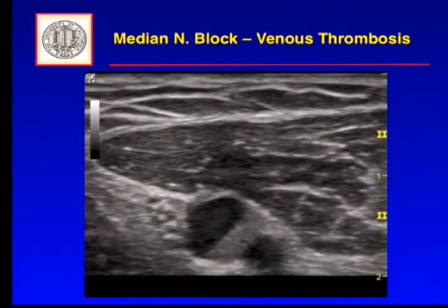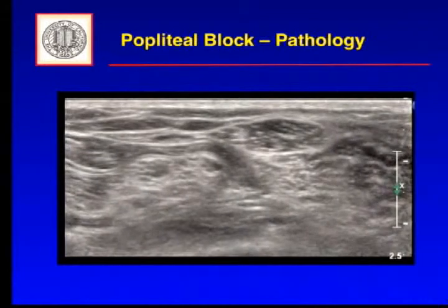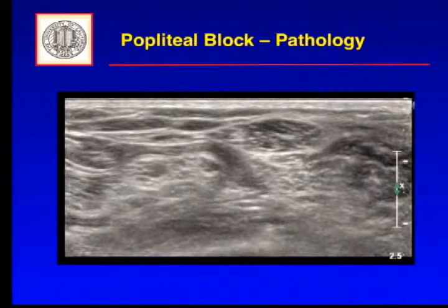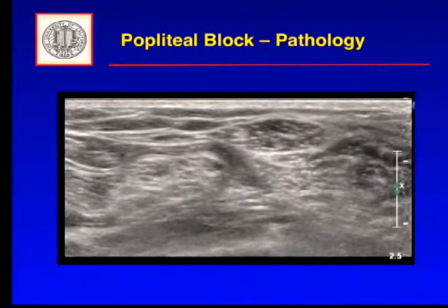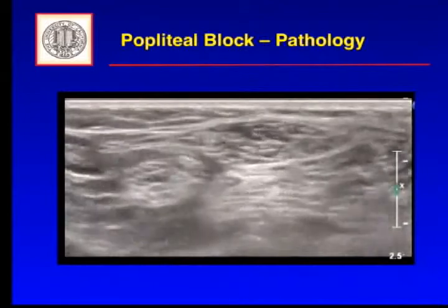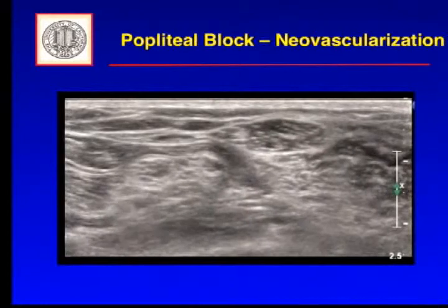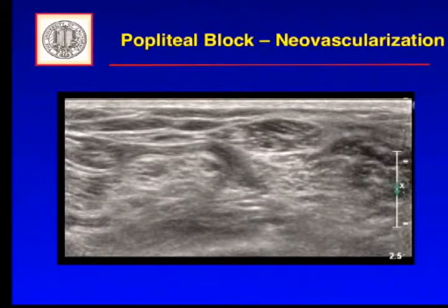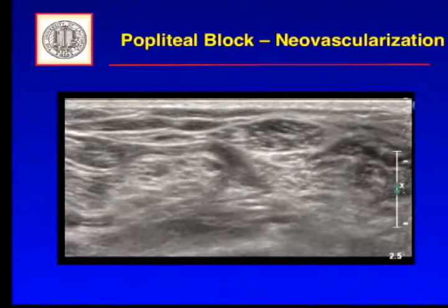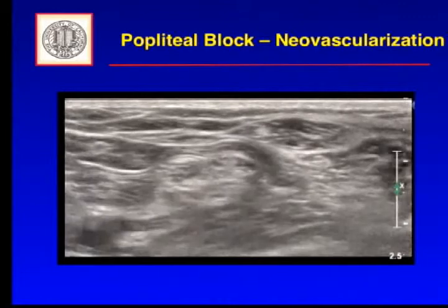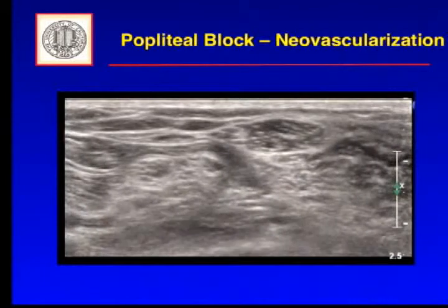For this popliteal nerve block, pay close attention — I'm seeing this more and more as I look more carefully. We're looking at the tibial nerve on the medial side and the common peroneal nerve. This patient has advanced diabetes, and this is neovascularization. When I see these pulsatile nerves I'm a little bit more careful. These people are more vulnerable to injury — they're forming new vessels because their current ones aren't functioning properly. You can compromise the blood supply, and the regenerative capacity is going to be limited. I'm always on the lookout for this when I block people with advanced diabetes.